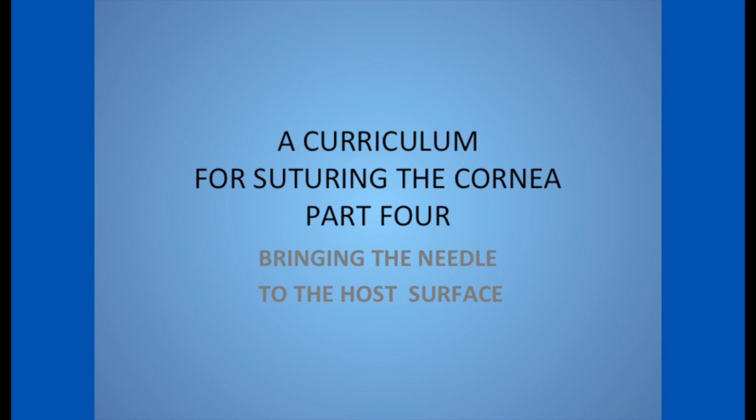Stay tuned for Part 4, where we'll learn how to bring the needle to the surface in a controlled fashion.